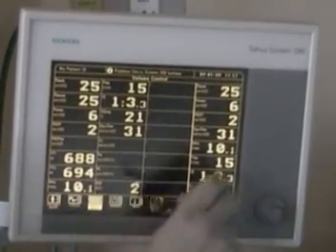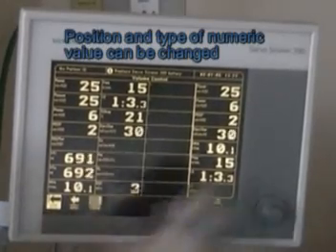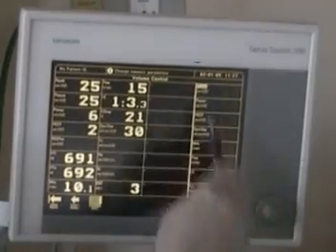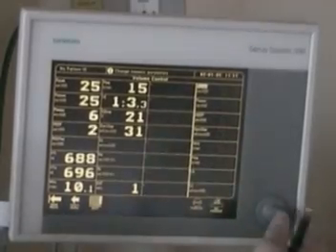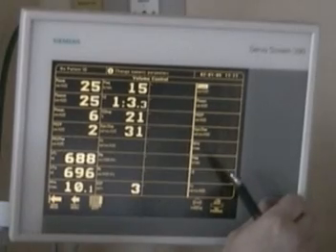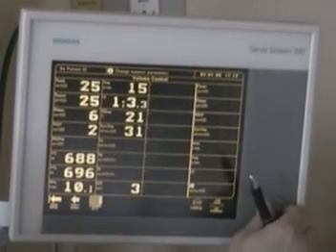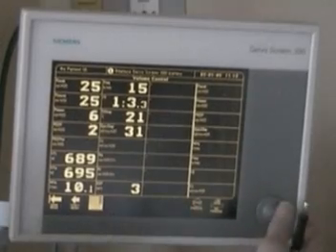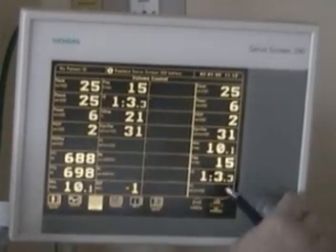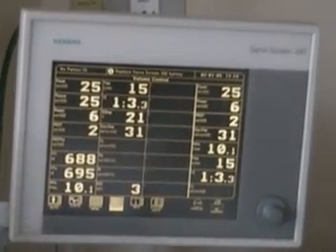We can change by clicking on the numerical values — pushing the button in — and we can change these parameters, add or subtract something, move them around if we choose to. We'll just go back here, exit, and back to the main menu. Let's take a look at trends — sometimes we want to see what has happened to the patient over time.